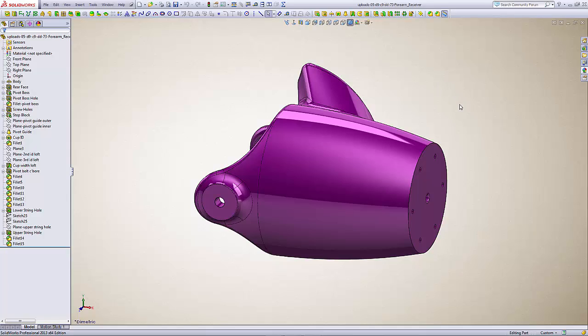This is a SOLIDWORKS version and as you can see over here in the feature tree, it's built from scratch. Originally my intent with this video was just to show how to modify the file itself, but I thought I'd go one step further and show my methods for coming up with the shape for the forearm of the recipient and making the cup actually match that.